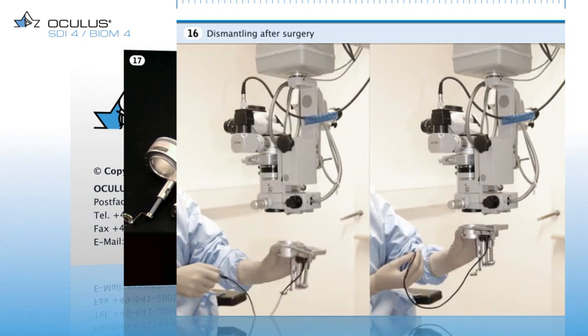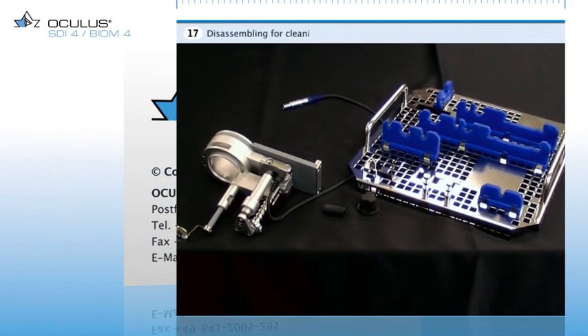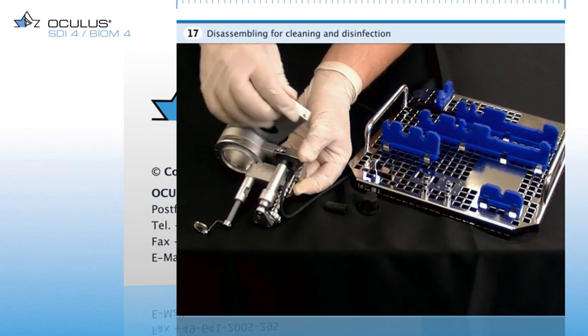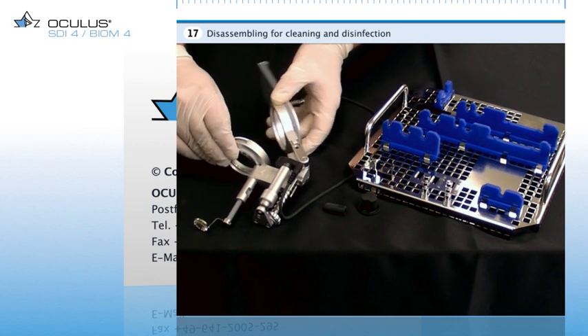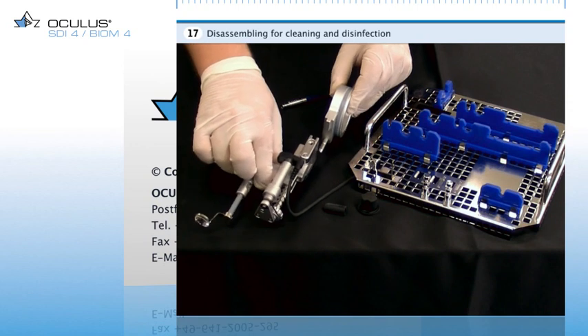During disassembly, the Biome components are placed on a table for further disassembly prior to cleaning and disinfection. For disassembling the Biome, swing out the adapter by 90 degrees and then remove it from the Biome. Place the adapter plate on the sterilization tray as indicated by the lasered-in instructions.